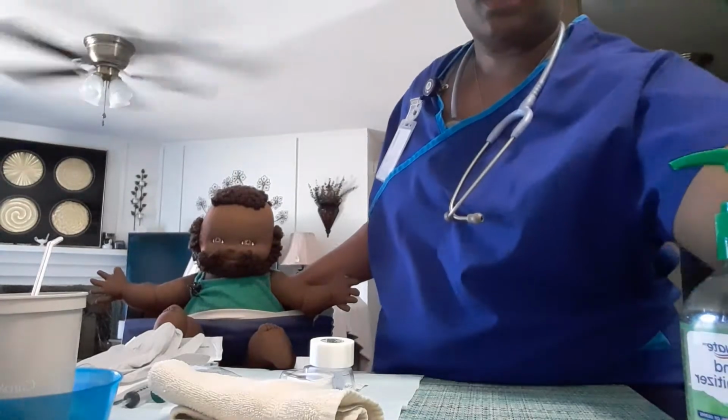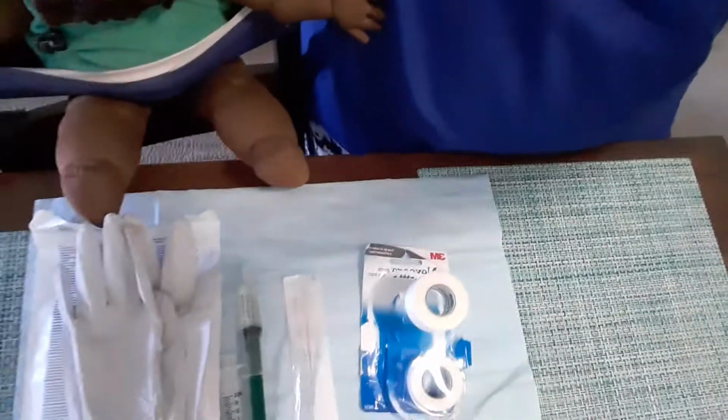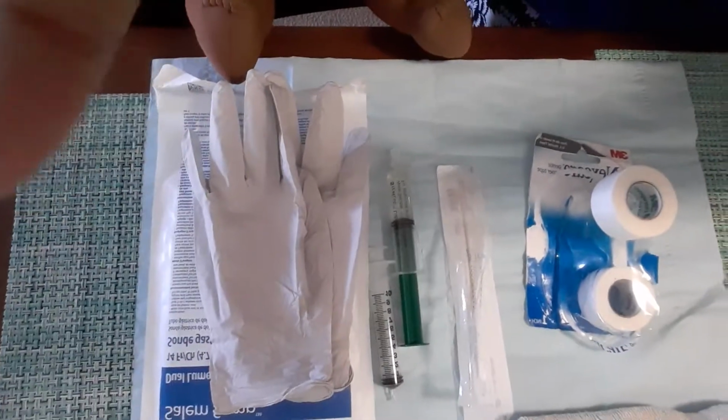Okay, and I have gathered my supplies here. You can see that. I'm sorry if you hear my cat running around. Okay, those are my supplies.